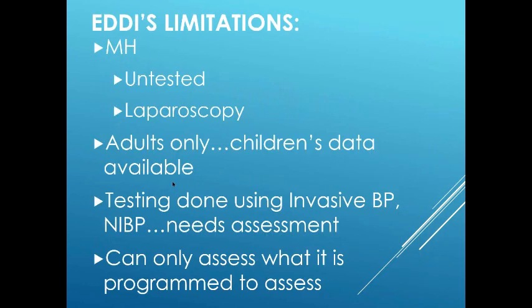Some of EDDI's limitations have been covered, but here is a summary. MH is untested because of its rarity, and there is a possibility that at the beginning of laparoscopy, an MH alert could be generated. We do have a database for the blood pressure changes in children, but at the moment it is only programmed for adults.